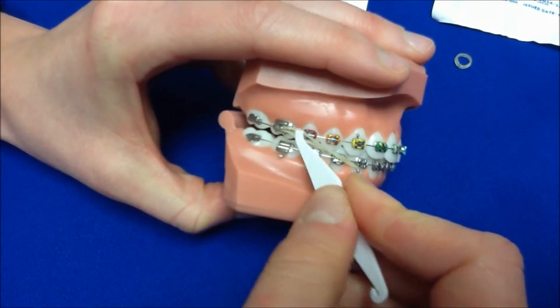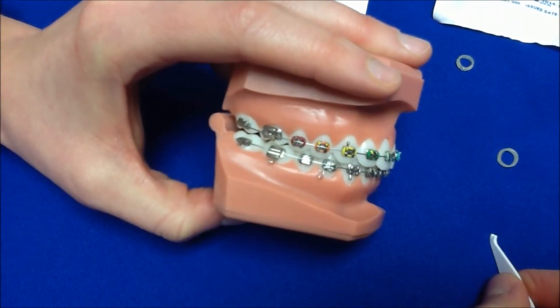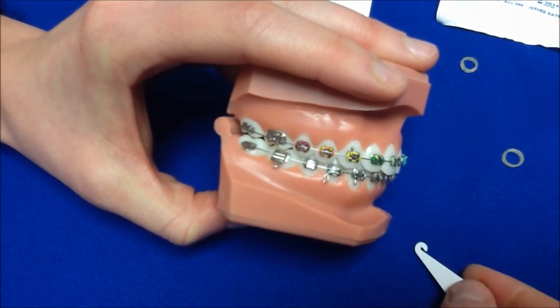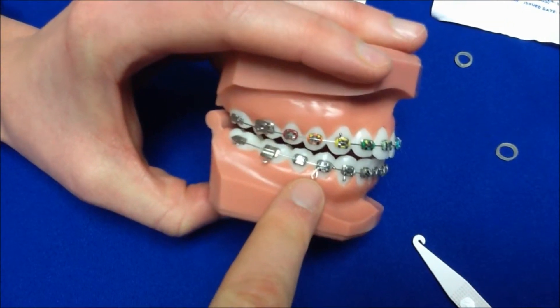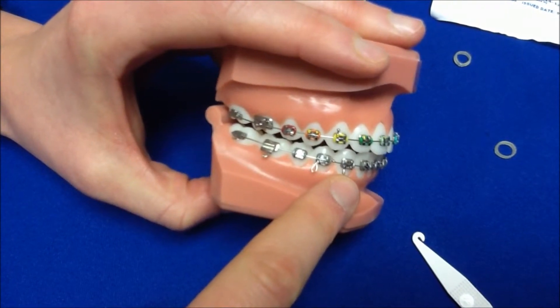Finally, another very common rubber band that is worn is the triangular elastic. It stretches from the lower premolar to the upper canine to the lower canine.